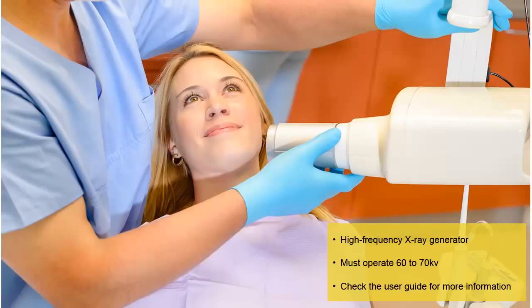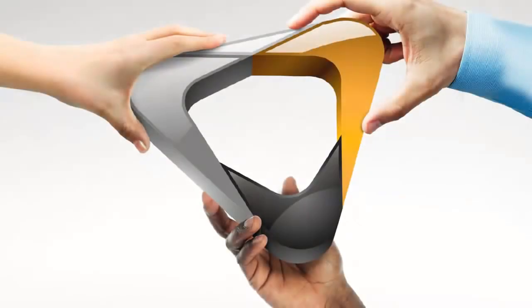The user guide provides a table of suggested exposure times for an X-ray generator output of 70 kV and 7 mA. These are suggested exposure times only, as exposure times vary by type and age of the generator. As a general rule, if the images appear too dark, reduce the exposure time. If the images appear grainy, increase the exposure time.